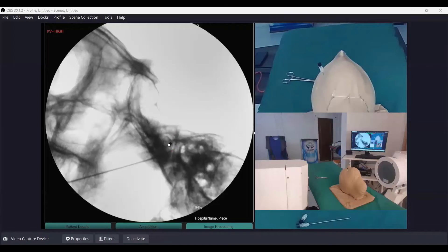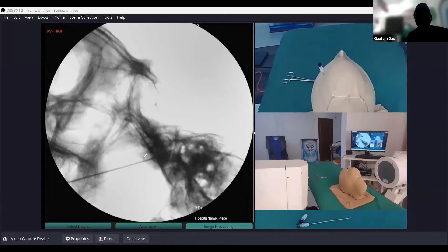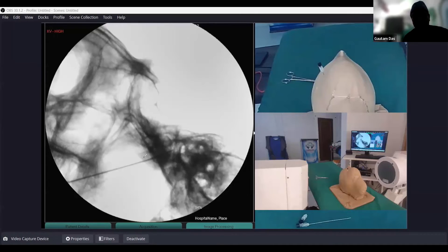Do not inject contrast here. Never inject contrast for this procedure. If you inject contrast, your needle tip will not be nicely visible. Contrast injection is done only when performing balloon compression — you inflate the balloon with contrast to see its position. For the radiofrequency procedure, do not inject any contrast because it will prevent you from delineating the needle tip clearly.